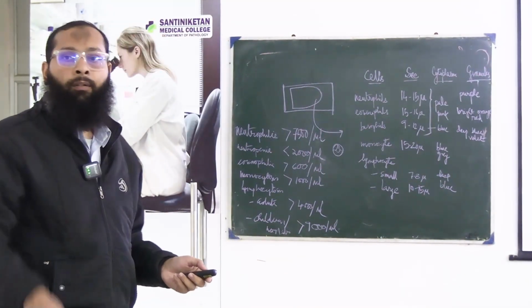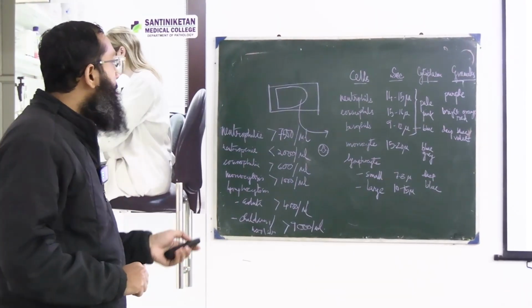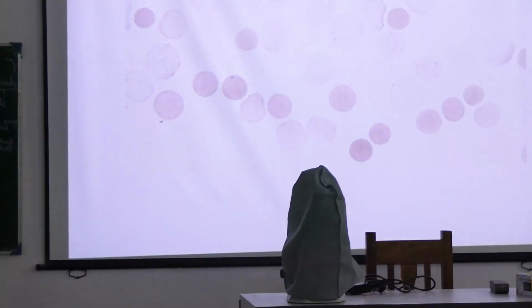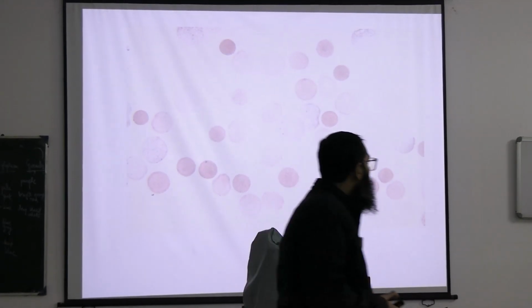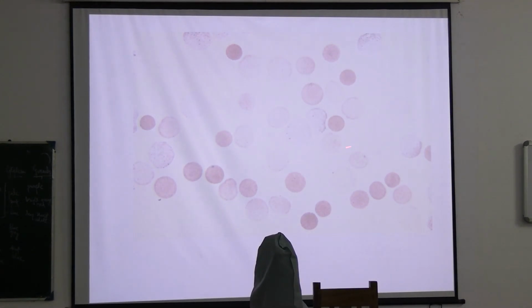So, now you please stand up and describe the RBCs present here. Size is different. Are they microcytic or macrocytic? What about the size? Micro, okay, fine.